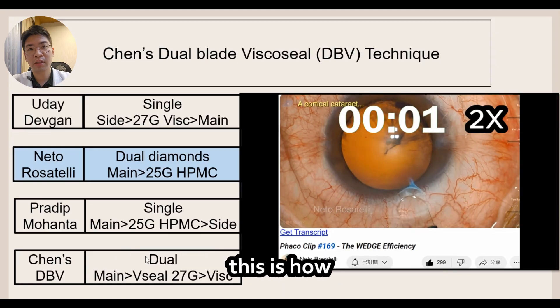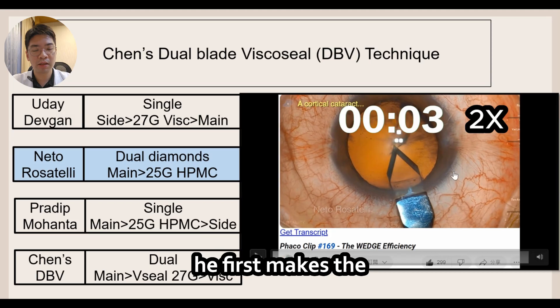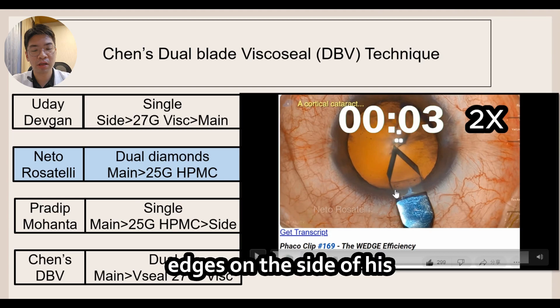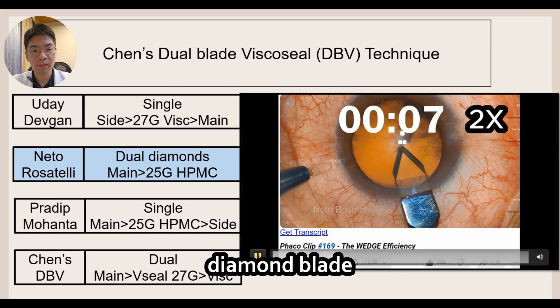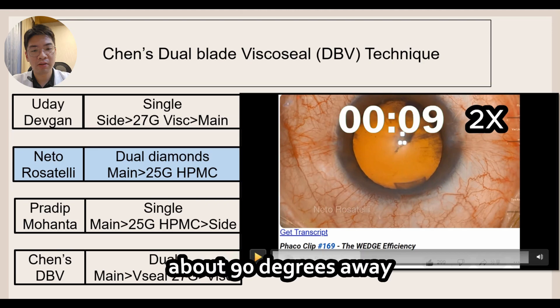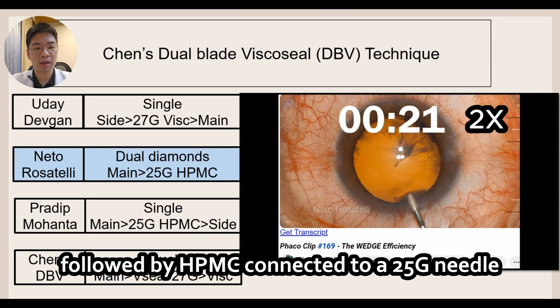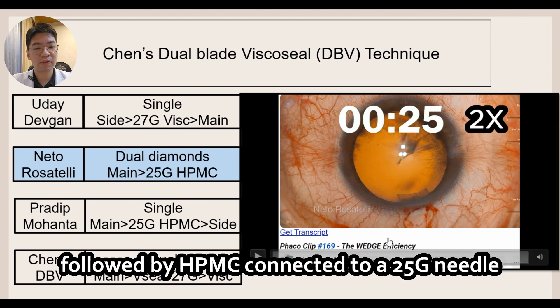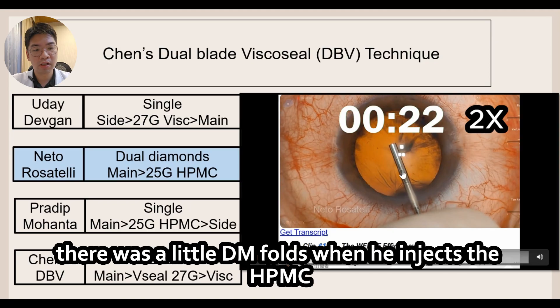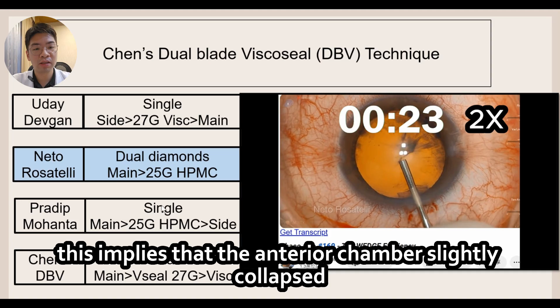Let's look at something different. This is how Dr. Neto Rosatelli performs his cataract incisions. He first makes the main incision with a diamond keratome — notice the dull edges on the side of the diamond blade — then performs the side port incision with the diamond side port knife about 90 degrees away. He then injects intracameral lidocaine followed by HPMC connected to a 25 gauge needle. There were slight Descemet membrane folds when he injects the HPMC, implying the anterior chamber slightly collapsed.